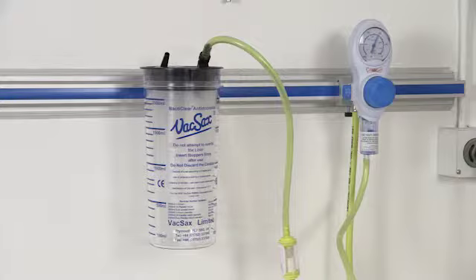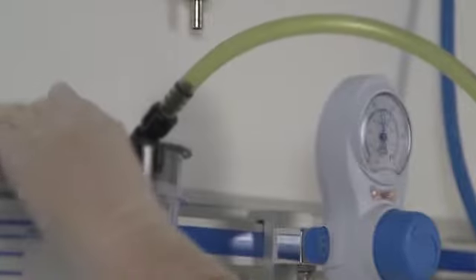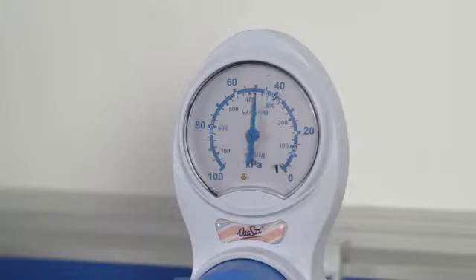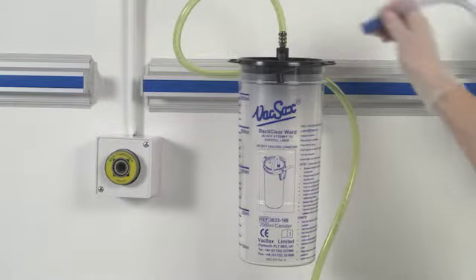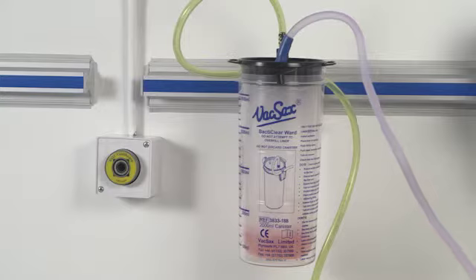Place your finger over the patient port located on the lid of the liner, ensuring a vacuum is present. Connect the patient tubing to the patient port. The suction unit is now ready for use.